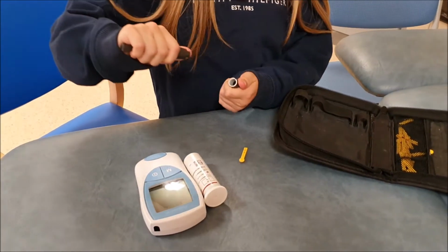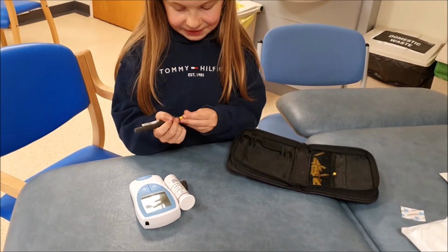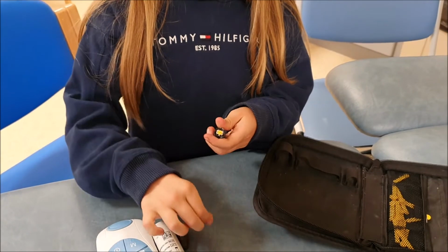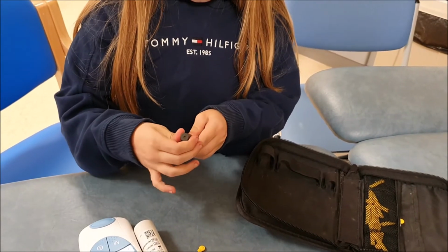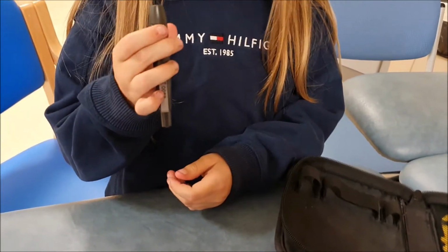And then take the lid off the pen. And then put the yellow needle in. And then twist it and there'll be a needle underneath. And then put it on until it clicks. And then put it on at least in the middle of 4 and 5.